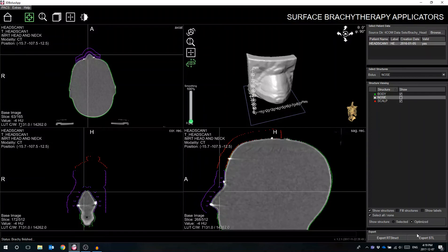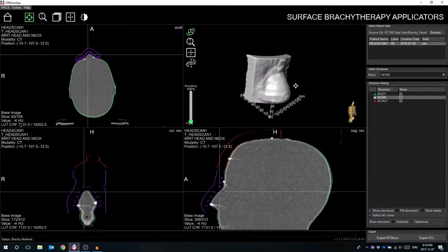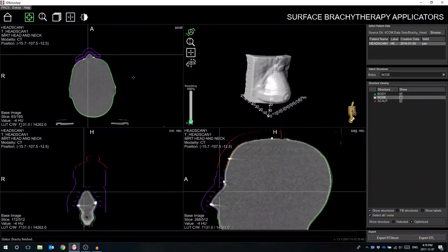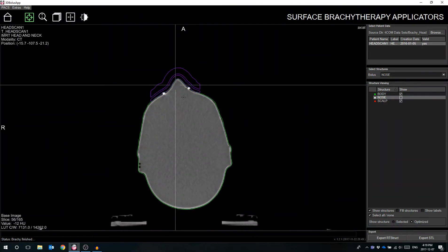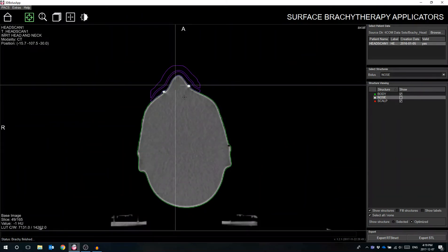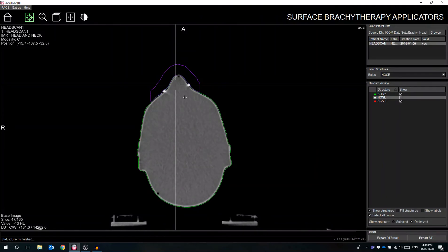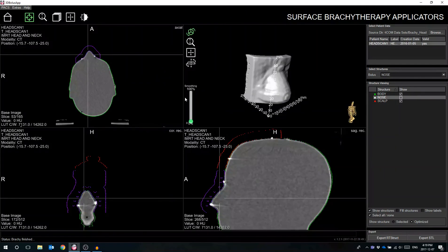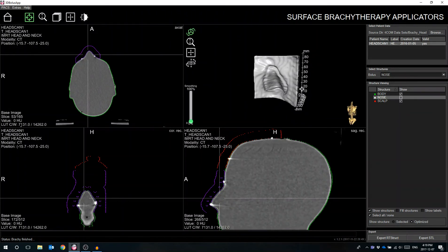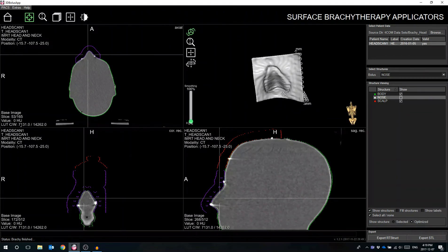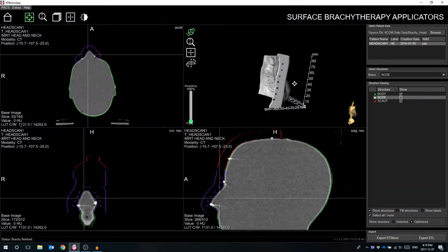The applicator can be printed in a matter of hours and does not require human intervention during the fabrication process. Once the part is complete, the user can immediately fit the applicator with after-loading catheters secured with support buttons to be used in the administration of HDR brachytherapy. With each accessory matching the contours of the patient's anatomy, therapists can sanitize and reuse each applicator for each fraction of treatment.